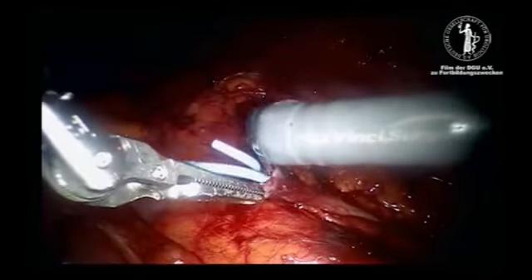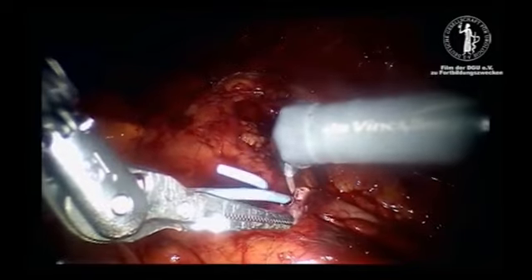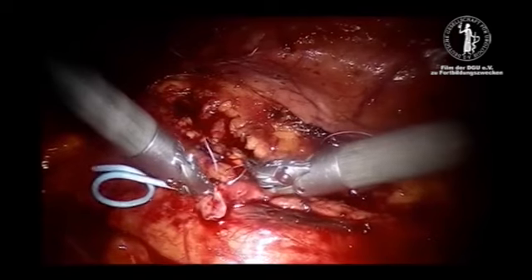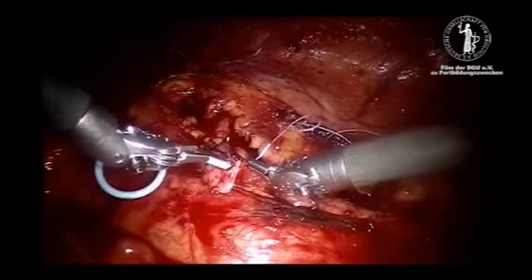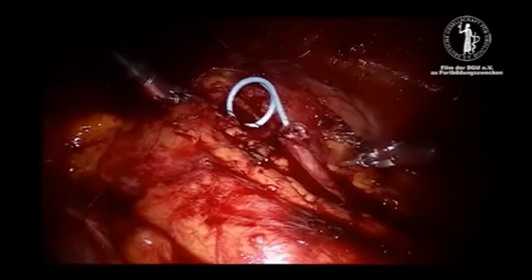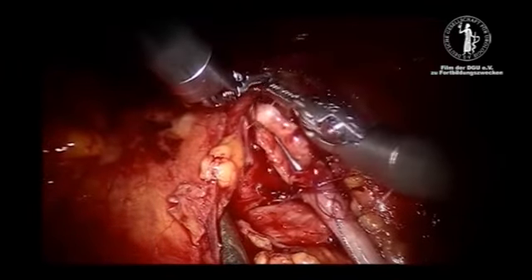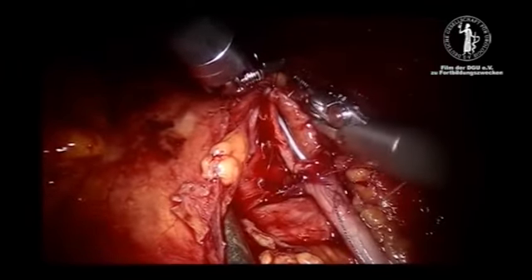The transected ventralized ureter is spatulated and the ureteropelvic anastomosis is sewn. Finally, the double-J stent is repositioned and the redimensioned renal pelvis is closed with a running suture.